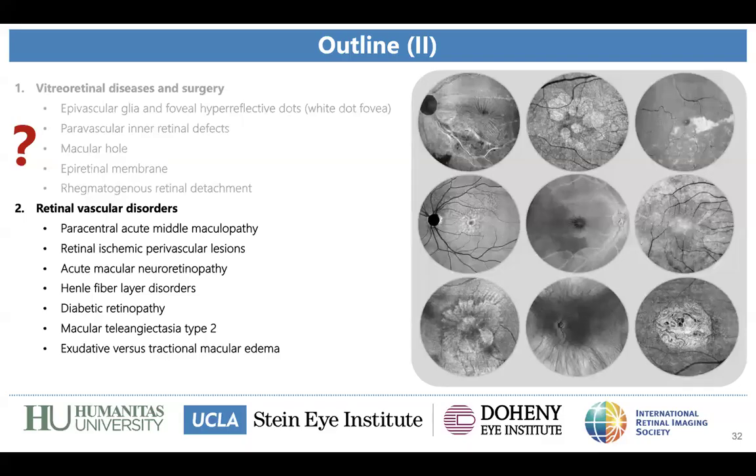But I think the possibility to manually adjust the slabs and avoid segmentation artifacts is actually pretty easy. I mean, we're talking about a non-invasive imaging modality that doesn't require dye. It only requires patient collaboration, and it's not even so long, just a few minutes. So I think manual segmentation and adjusting point by point for each layer we are interested in is the answer in these cases. Awesome, thank you.